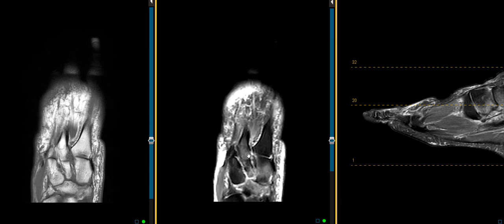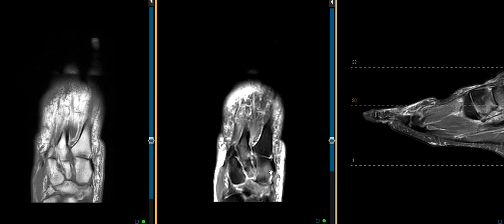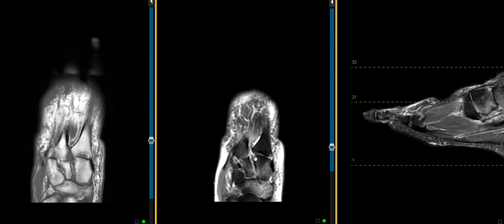And we see a little area of brightness right here. So this is the attachment. And it is yanked off that bone, and it's hanging out here. There's the end of it there, so it's not attaching. So we have a ruptured Lisfranc ligament.